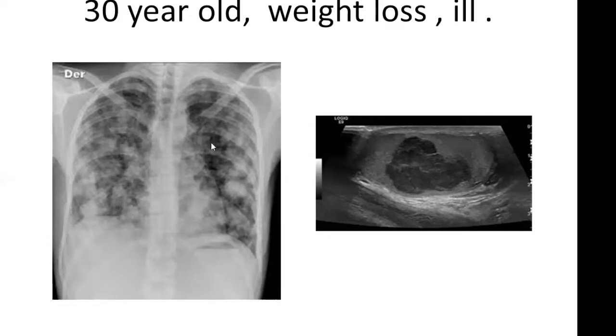These are multiple soft tissue masses. We think it's tumor, benign or malignant. We think it's malignant. There are multiple soft tissue masses in all zones. Is it primary or secondary? Well, these are most likely secondaries. In a young man, we'd be thinking about doing an ultrasound of his testes.